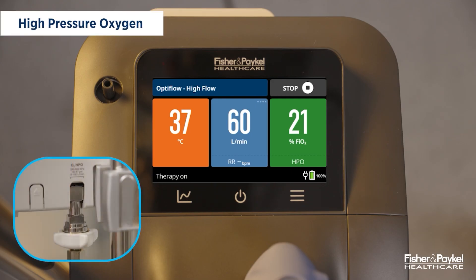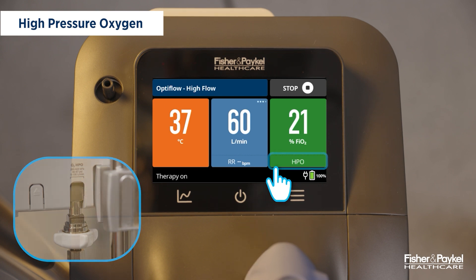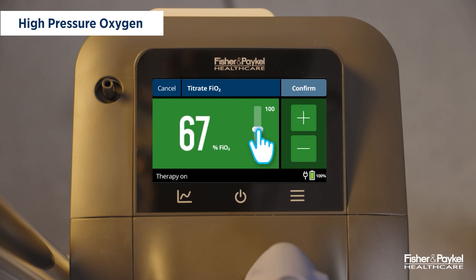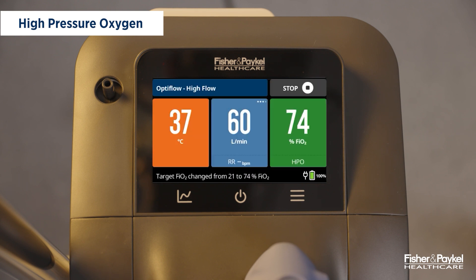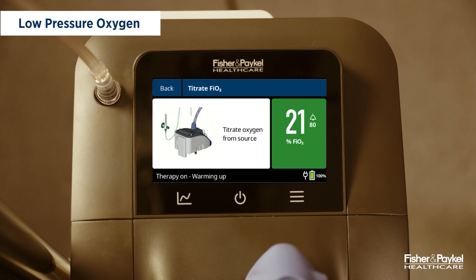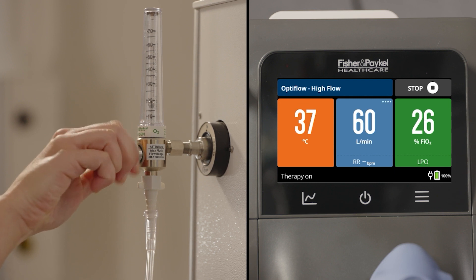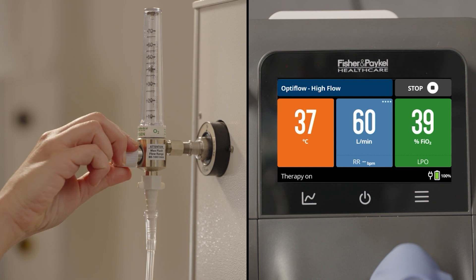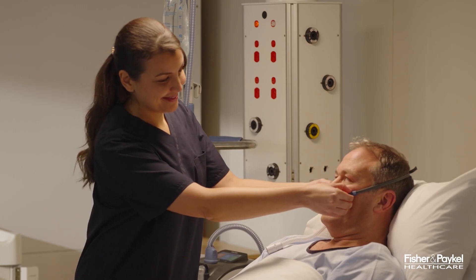If oxygen is connected to the high pressure oxygen port, FiO2 can be adjusted on the Evo3 and HPO will be displayed. Tap the oxygen tile and set the desired value; the oxygen tile on the home screen will display the target FiO2 value. If oxygen is connected to the low pressure oxygen port, LPO will be displayed. The Evo3 does not directly control the FiO2 in this case — use an external flow meter to adjust the FiO2 to the desired level. The oxygen tile on the home screen will display the measured FiO2 value.